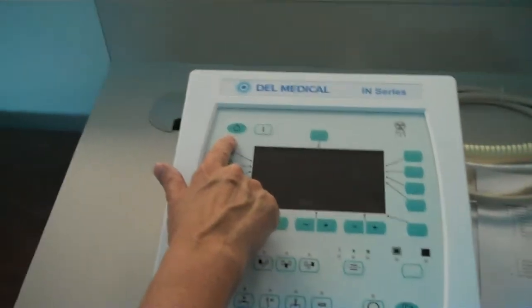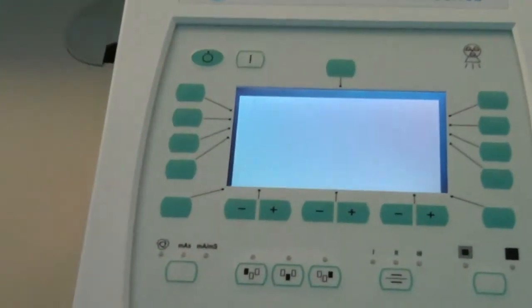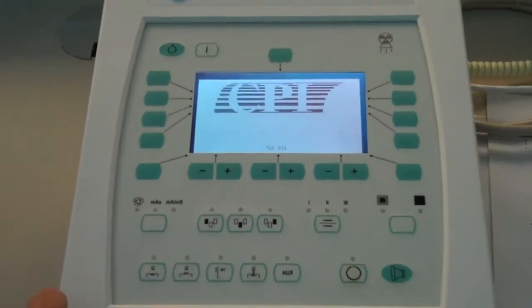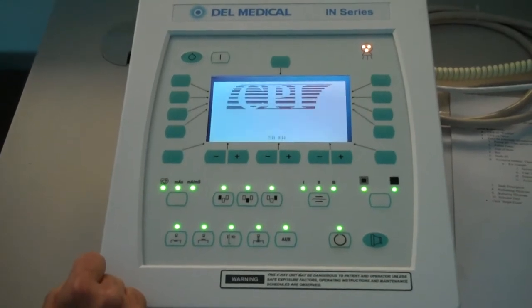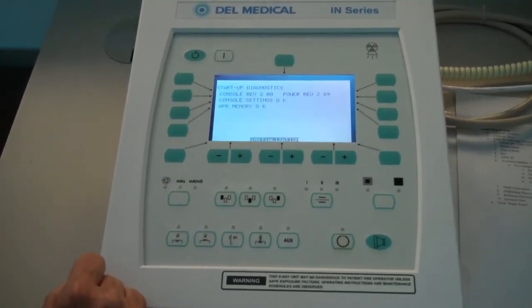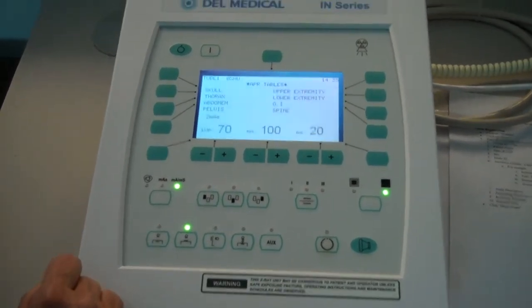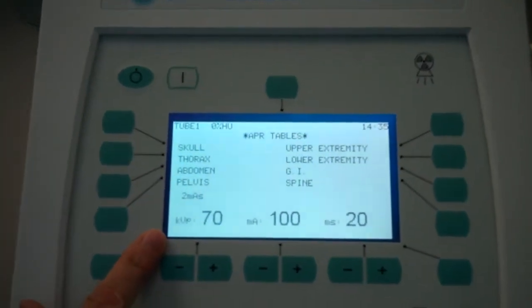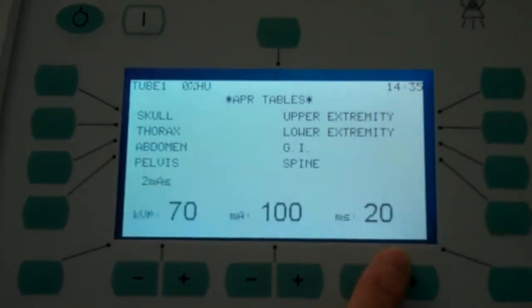We have on and off switches. We are going to activate or turn on, and the LCD will illuminate and bring up initialization. You will see KVP, MA, and milliseconds.